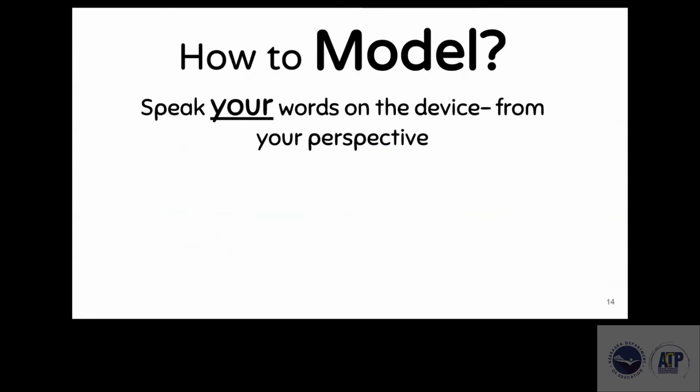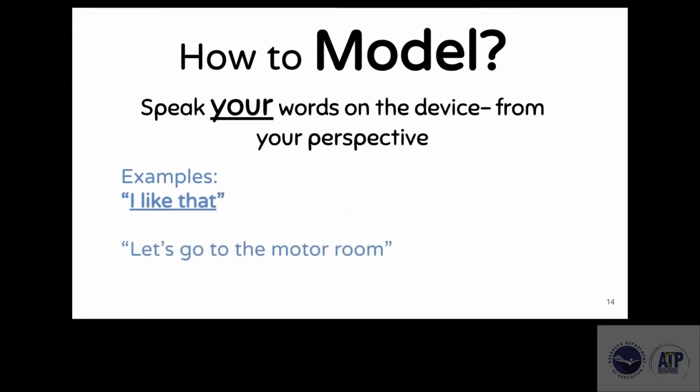The first that I'm going to share is some examples of speaking from your words on the device, from your perspective as the communication partner. Some things you could say are things like, I like that, or let's go to the motor room, or I don't like that.